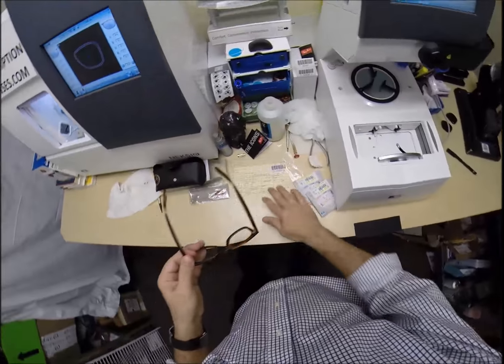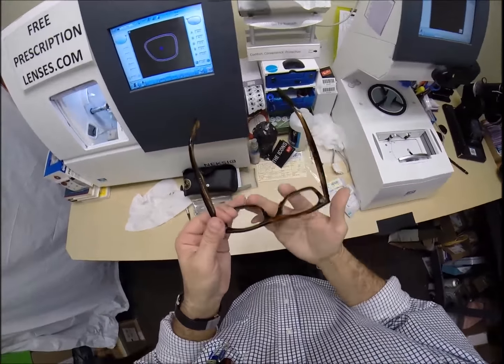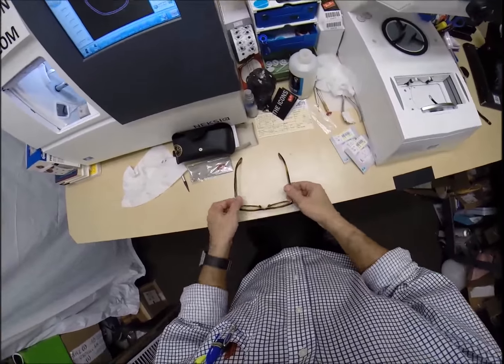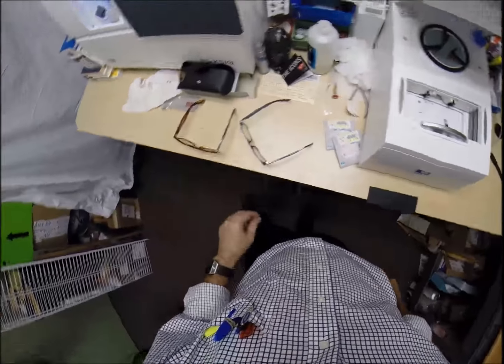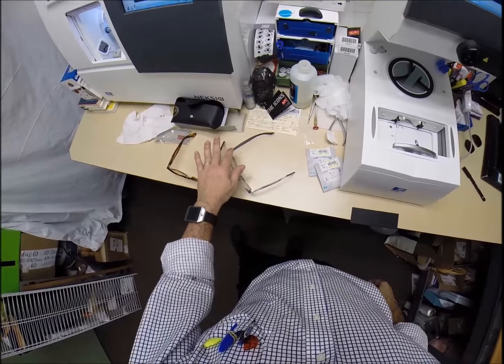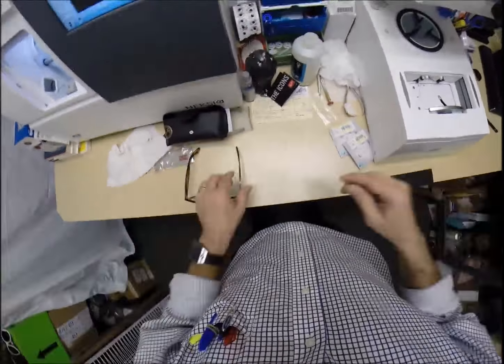But again, I'm going to get these in standard alignment, also known as a 3-point stance. The 3 points are 1, 2, and the bottom of the frame being 3. I set them on the counter and press down. There is no wobble. When I take mine off, they wobble on the counter, but they sit level on me. Let me put mine back on so I can see what I'm doing. Flip that over, no wobble. Close each temple to make sure they overlap perfectly, and they do. And that neither temple is askew.